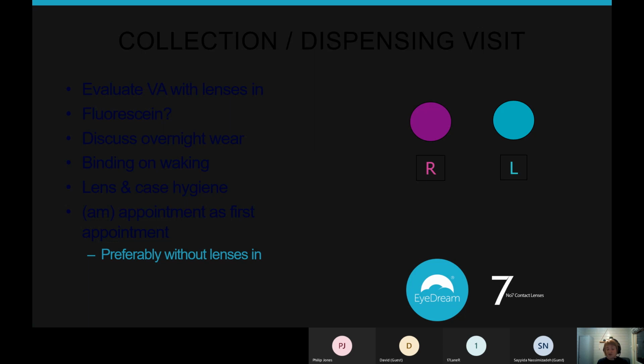So it doesn't really matter how vigilant you are about washing your hands, you're still then going to handle those. And so she pointed out that it's better to keep your lens case and solution outside of the bathroom, and maybe just use the bathroom for the mirror and the sink. And she also finished the presentation by asking everybody where they keep their toothbrush and pointing out that the toilet aerosol can go 6 feet and land on everything that's around there. So a lot of people at that point were thinking about where they might keep their toothbrush in the future.